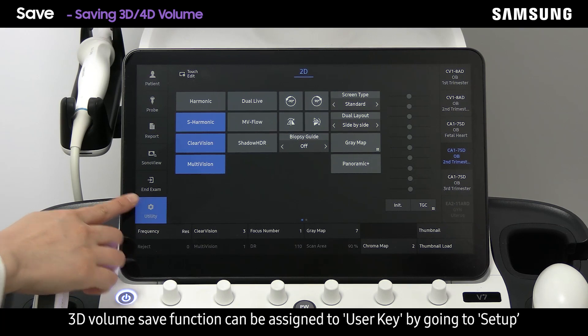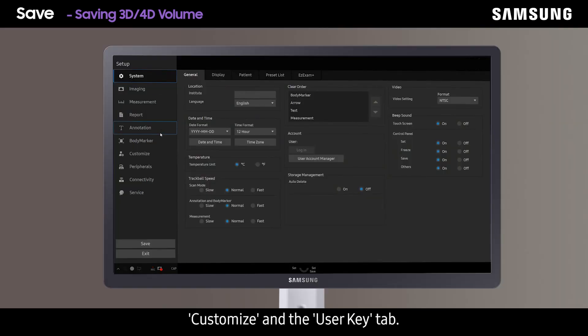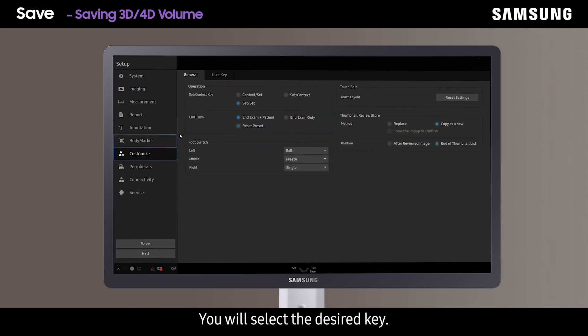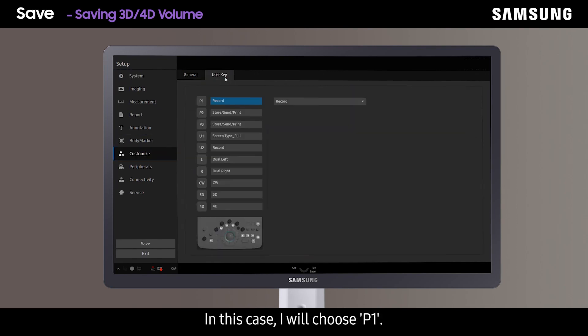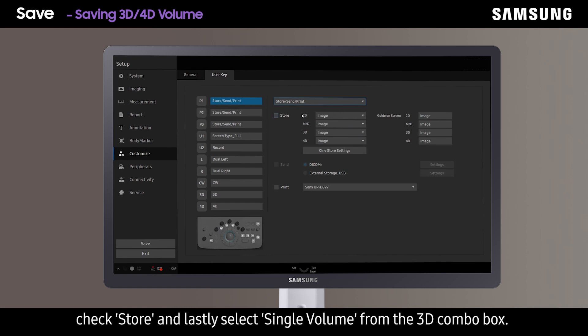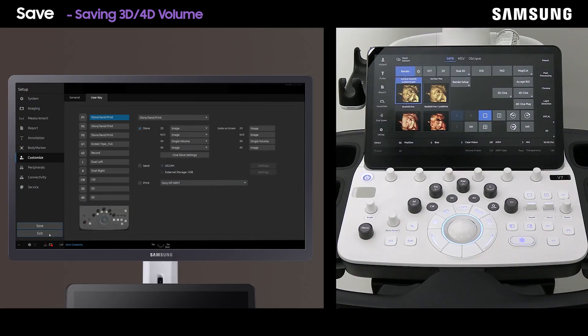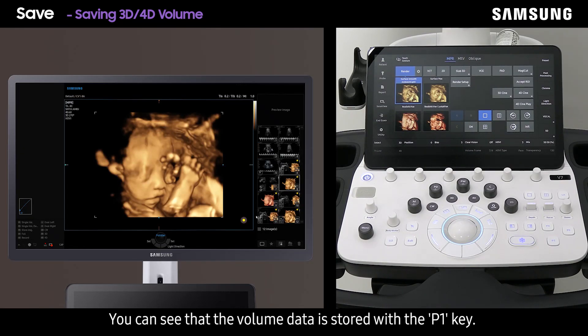The 3D volume save function can be assigned to a user key by going to Setup, Customize, and the user key tab. Select the desired key — in this case I will choose P1 — then select the store/send/print option, check store, and lastly select single volume from the 3D combo box. You can see that the volume data is now stored with the P1 key.